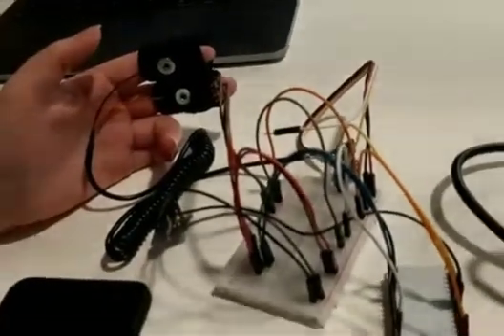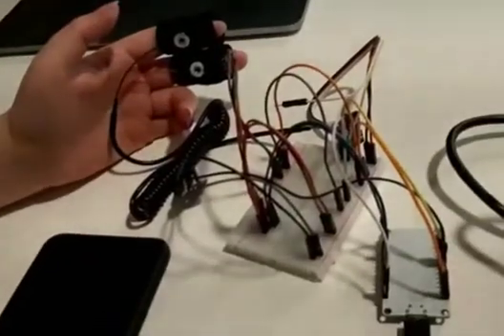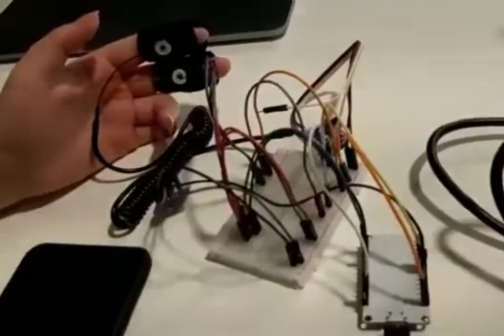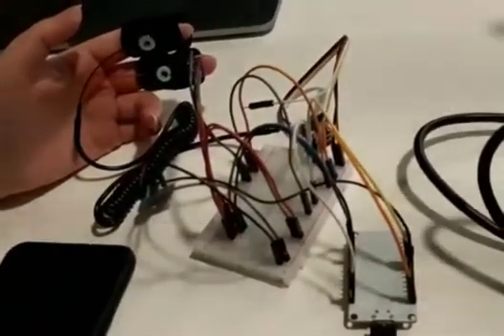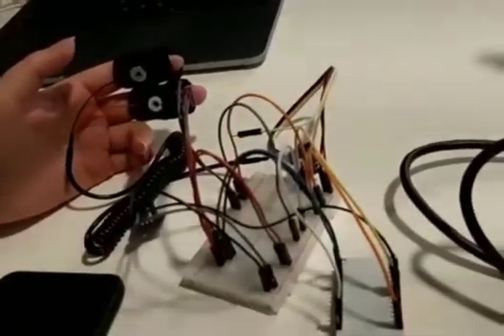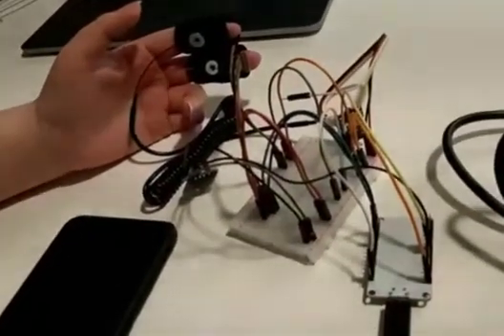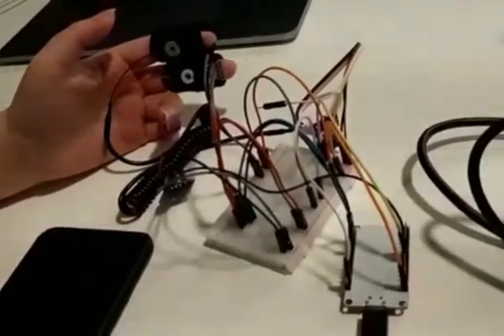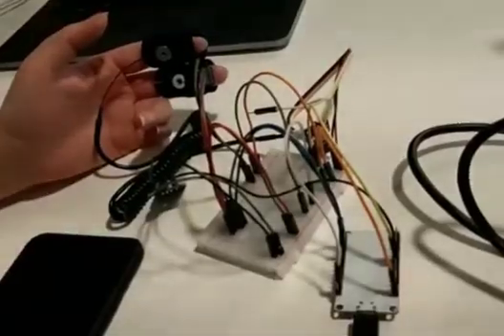This is the live demo of our wearable device and Android app. Now we're not wearing the device and everything is stable. You can hear the buzzer is not ringing, so no abnormal value has been detected. To demonstrate the project, we set the benchmarks really low, so minor emotional changes would also trigger the alerting process. Theoretically speaking, the GSR sensor value should be considered below the benchmark now. But the temperature sensor value is still good, so the alerting process has not been triggered yet.